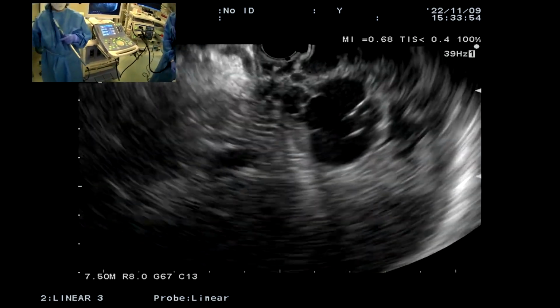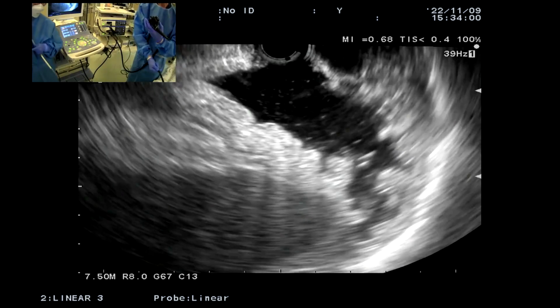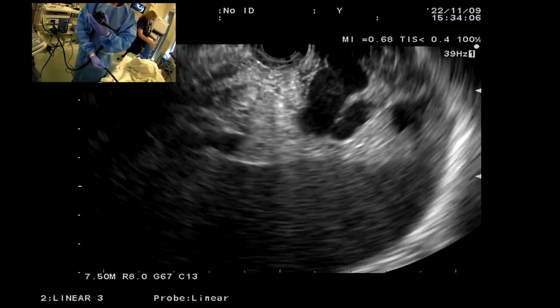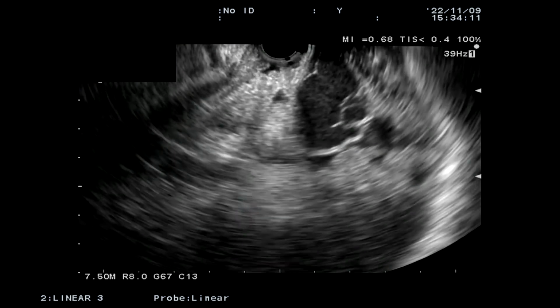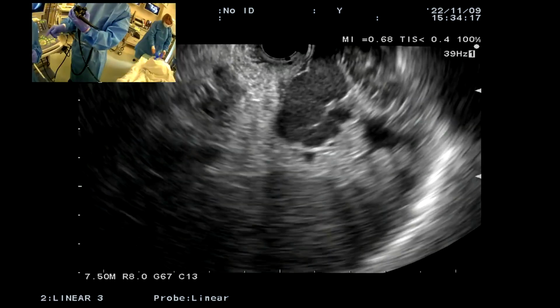So here, once again, we see very nicely, this is the varix. And we could, but we don't need to put more water into the fundus. But you see here the fundus, right? And so here's the varix. Good, so this is a good position, and we want the camera to show what the assistant's doing mostly, and maybe my hand. And let's now puncture.